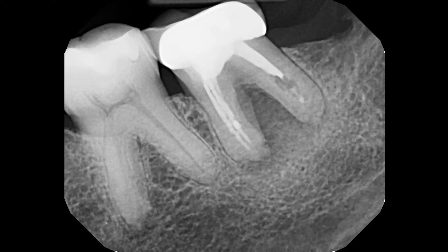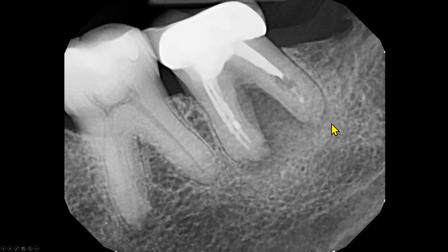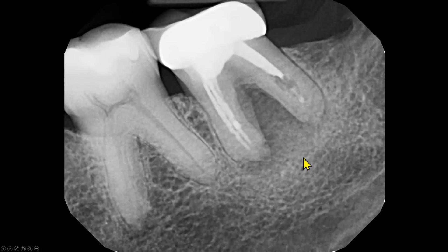On this periapical radiograph, the second molar is partially obturated. We can see a low-density area in the interradicular region. Compared to the first molar, the periapical area of both roots have slightly low density. Beyond the low-density area, we see an area of increased density.